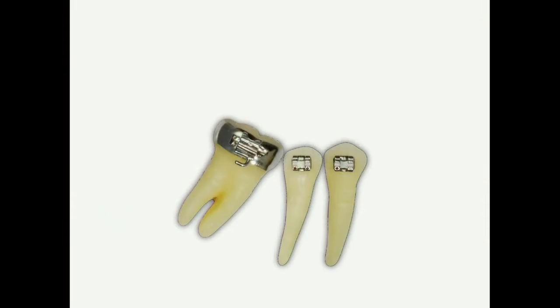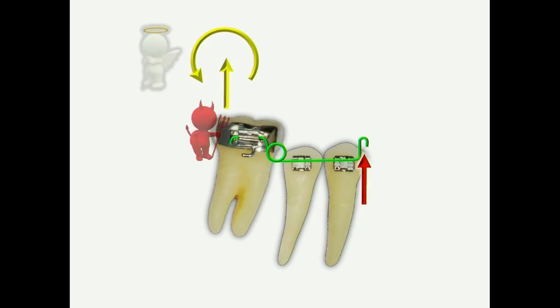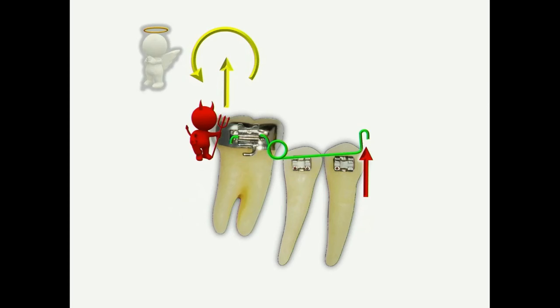Let's take a look at a similar but slightly different case. Will the tip-back spring be consistent in this case? The direction of moment is correct or desirable, but the extrusive force on the molar will make the situation worse if the patient is open bite by tendency. Therefore, in this case, the cantilever spring is not indicated because it is inconsistent.